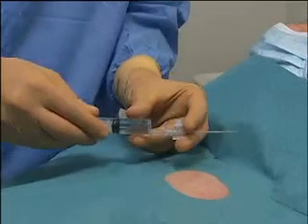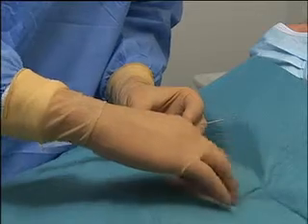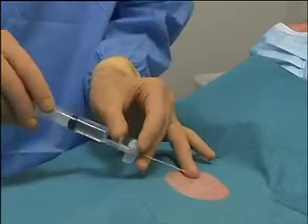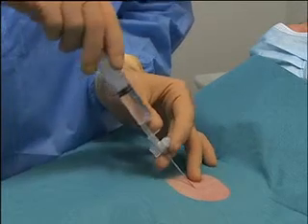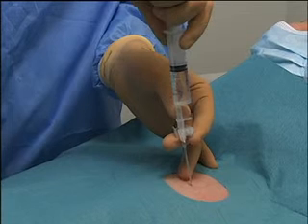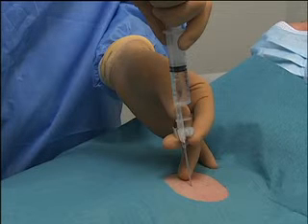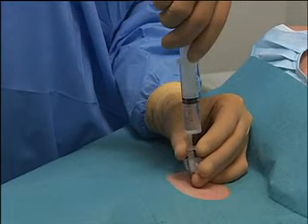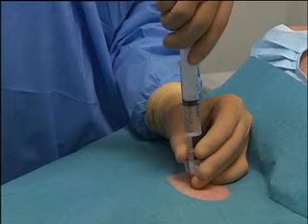Connect the over-the-needle catheter to the 10 ml lidocaine syringe, which should be partially filled with the remainder of the local anesthetic. Stabilize the skin with the non-dominant hand and puncture the skin with the catheter using the same landmarks that you used for the local anesthetic. Continue to aspirate with the syringe, slowly progressing in the direction of the pleural space.